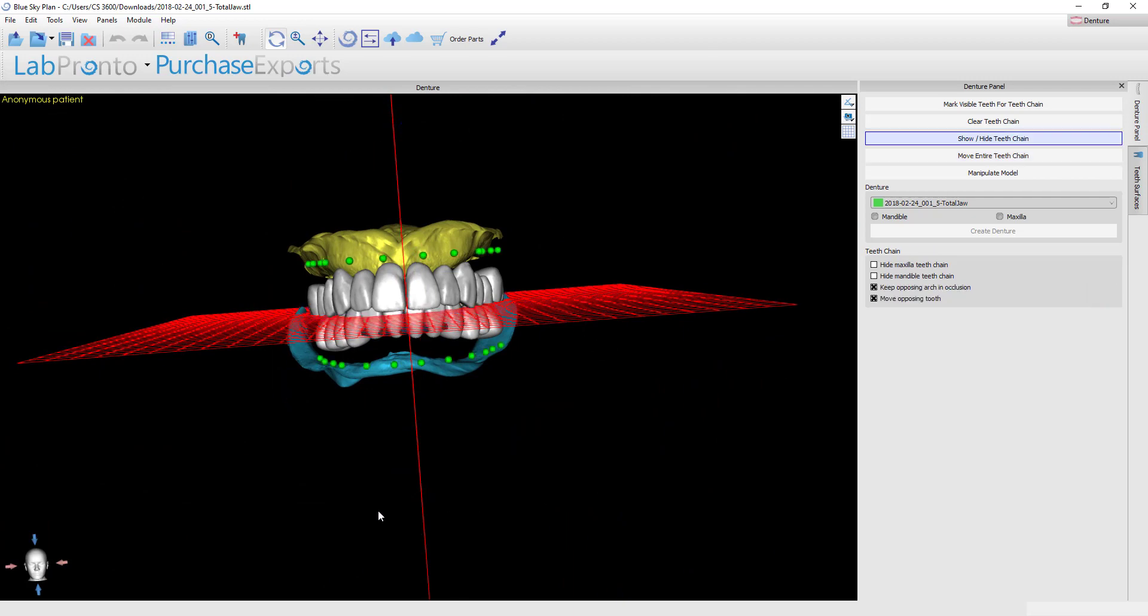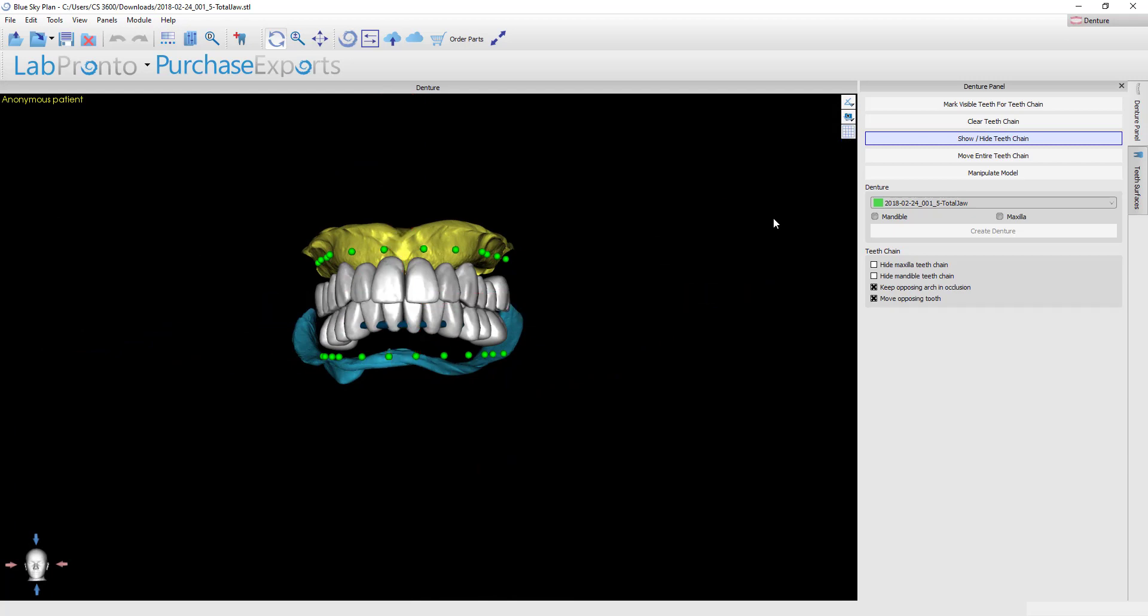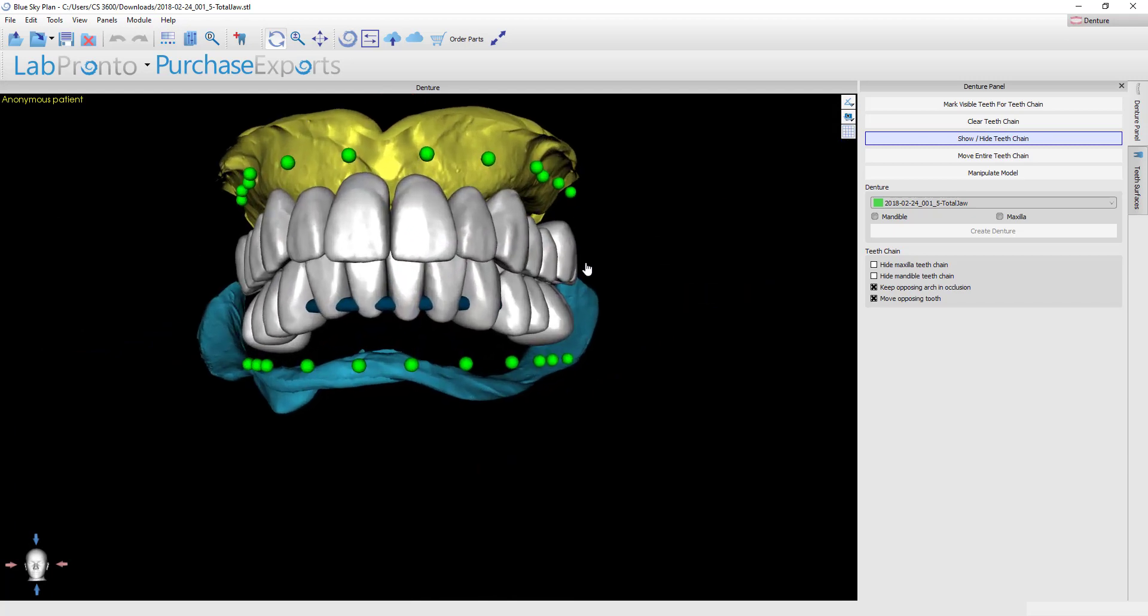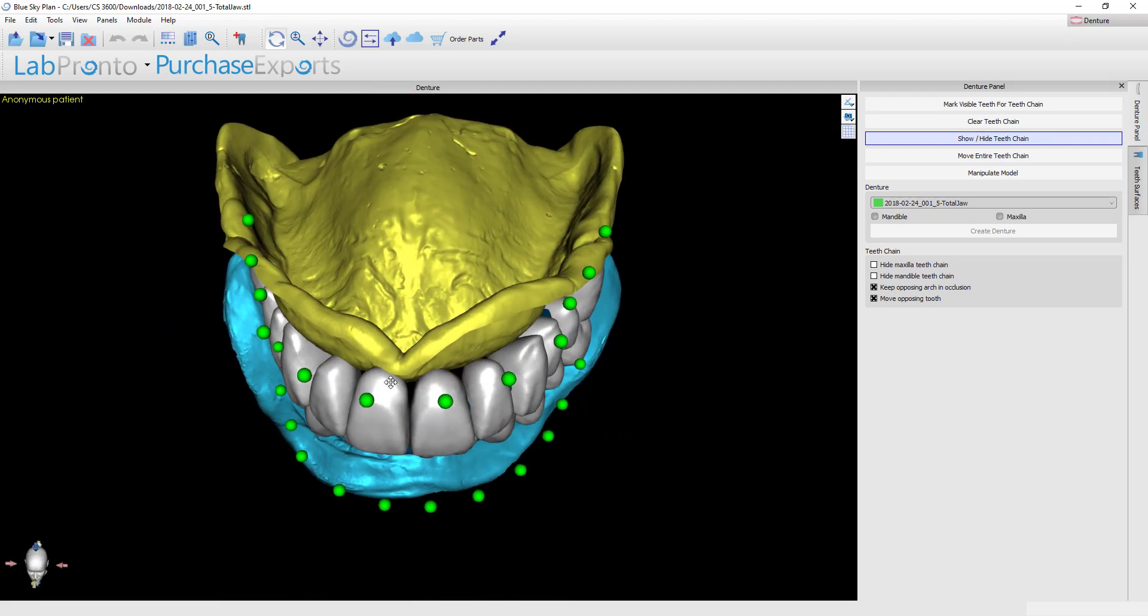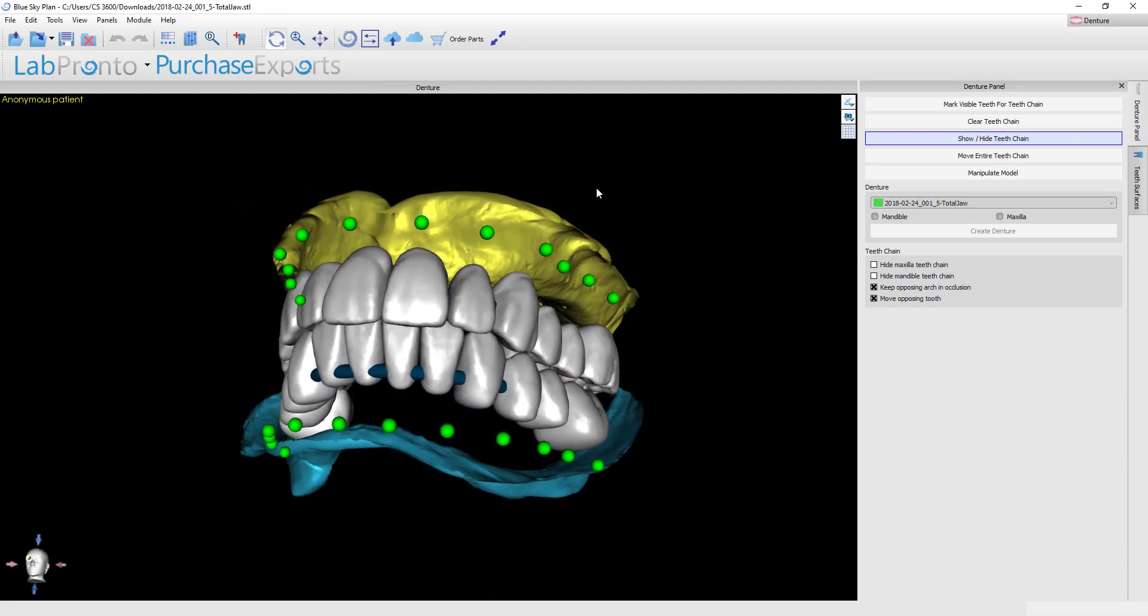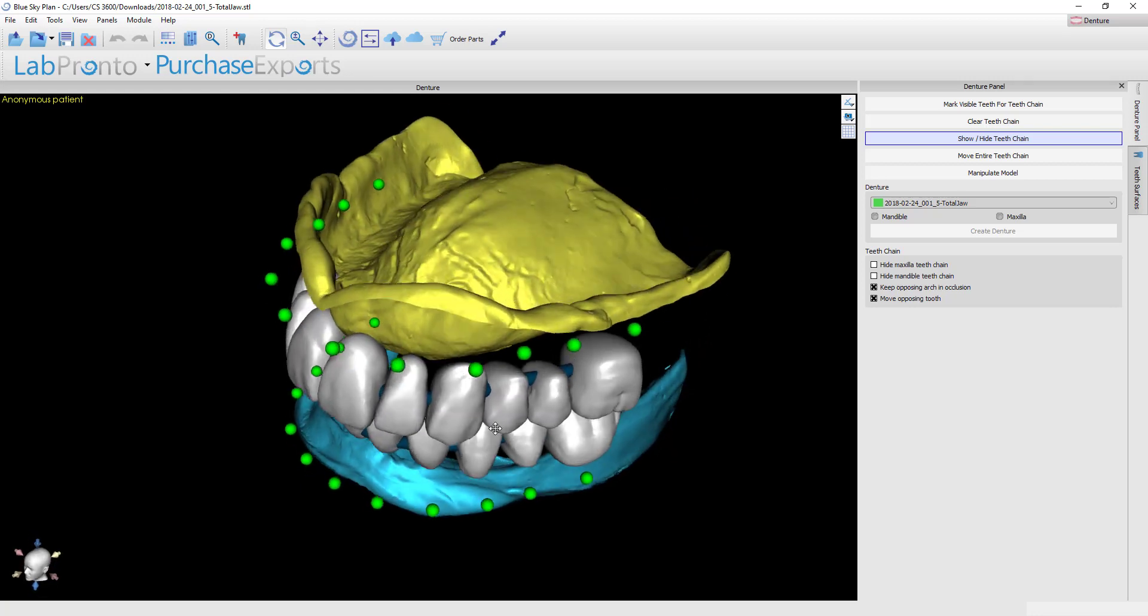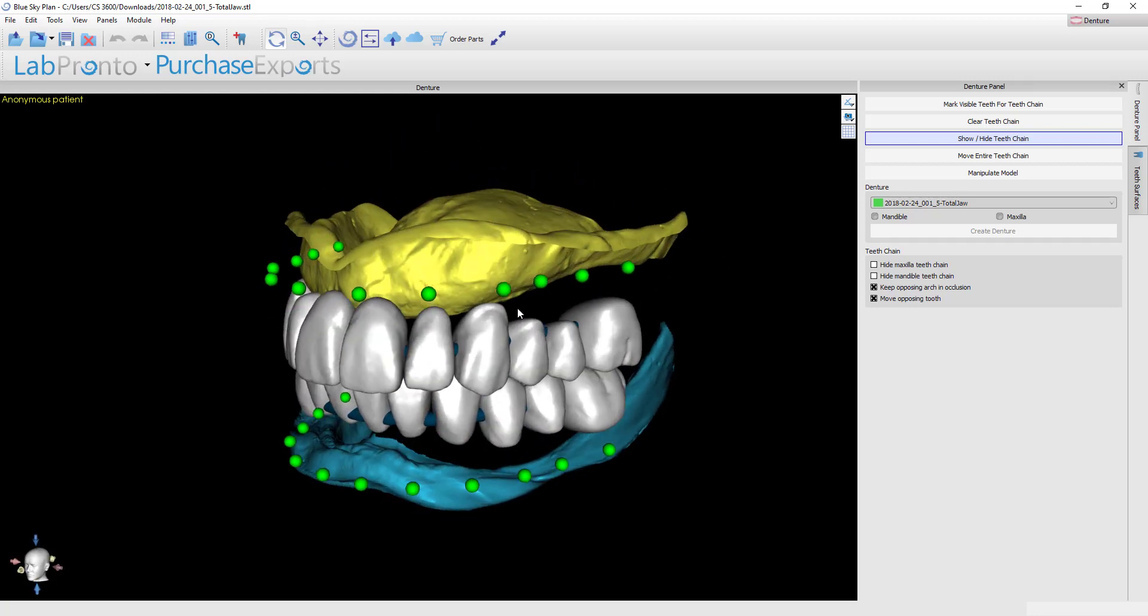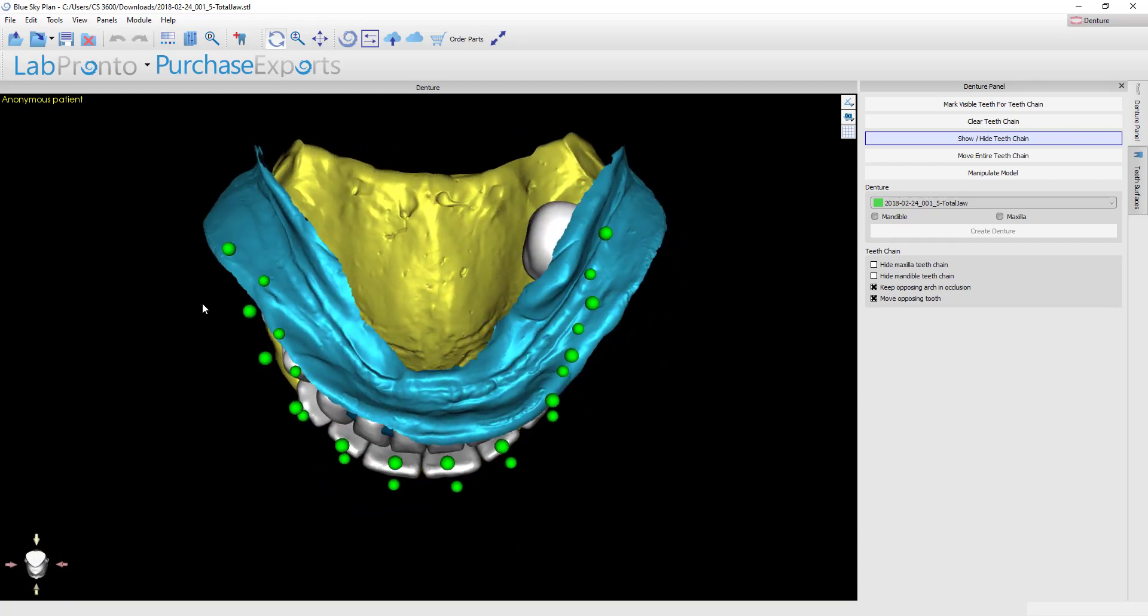By doing that it reestablishes the proper distance between the teeth and it will allow you to now turn this tooth chain button on. When you turn on the tooth chain button you're going to see a bunch of nodes appear over each tooth and what these allow you to do is to now lock the teeth at a particular position and then you could rotate and hinge all of the teeth behind that off of that distal of the tooth that you locked.